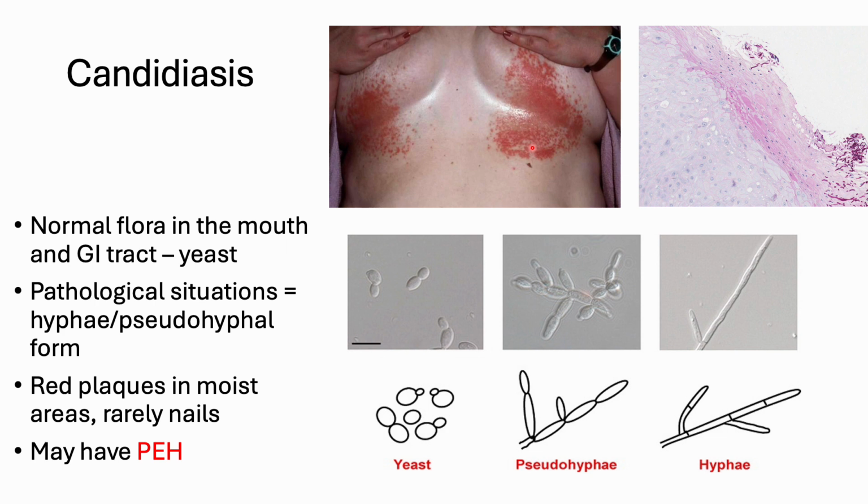So clinically, we got a lot of biopsies from the lip or from the corner of the mouth, and they said this is a verrucous lesion, rule out squamous cell carcinoma. And when we stain with the PAS, we see abundant Candida overgrowth. Then usually we say there is a pseudoepitheliomatous hyperplasia in association with the candidiasis, and we would recommend them to treat the Candida first.